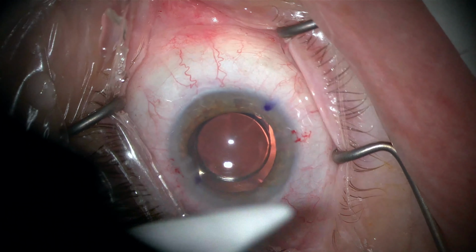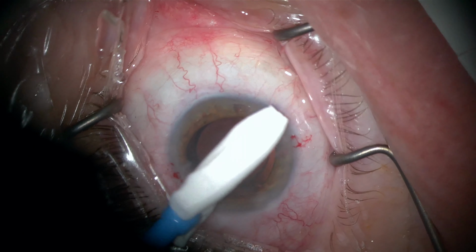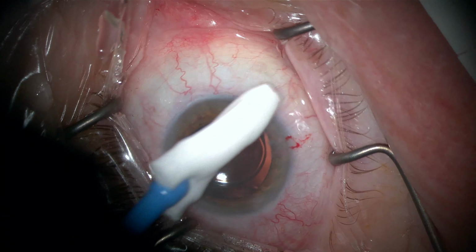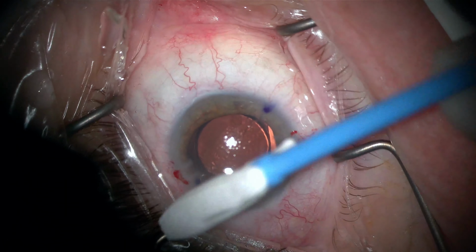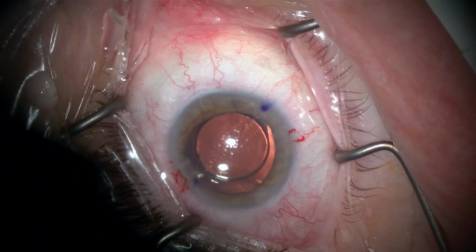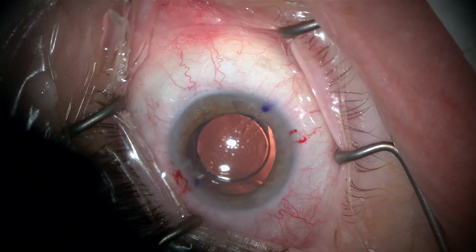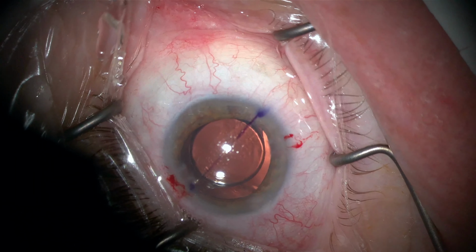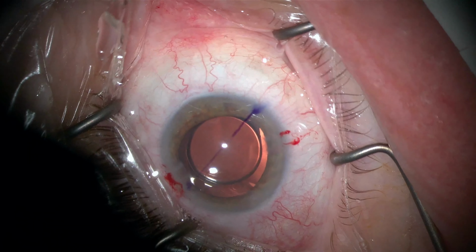I augmented the 104-degree axis one more time. I typically use an inked suture, which provides a really nice thin mark on the corneal surface and really allows you to get a very good alignment of your toric IOL.